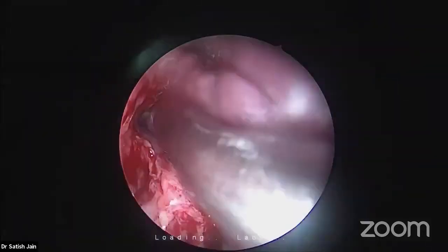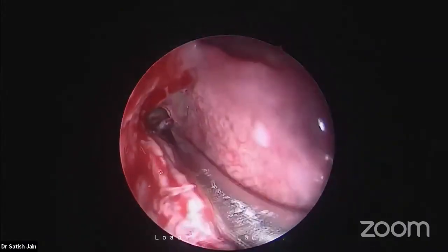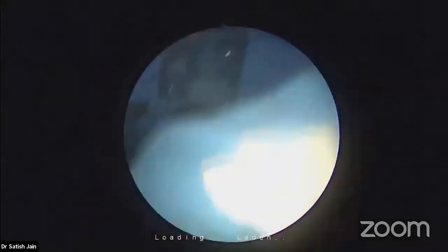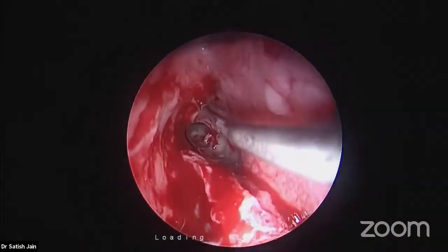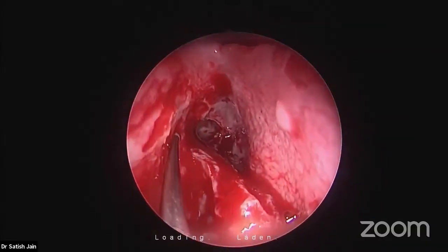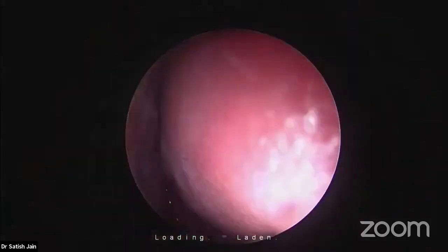See, I told you once you work far anteriorly here, you don't have to look for the anterior ethmoidal artery at all. See my beak, where the beak is ending. See where the beak is ending. What is there? Frontal. Again. This is the beak. Can you see? Beak, and the beak ending is frontal sinus. What you need to see is stay between the lateral limit, medial limit, go along the beak where it ends in the frontal. And you are working in the anterior trajectory.